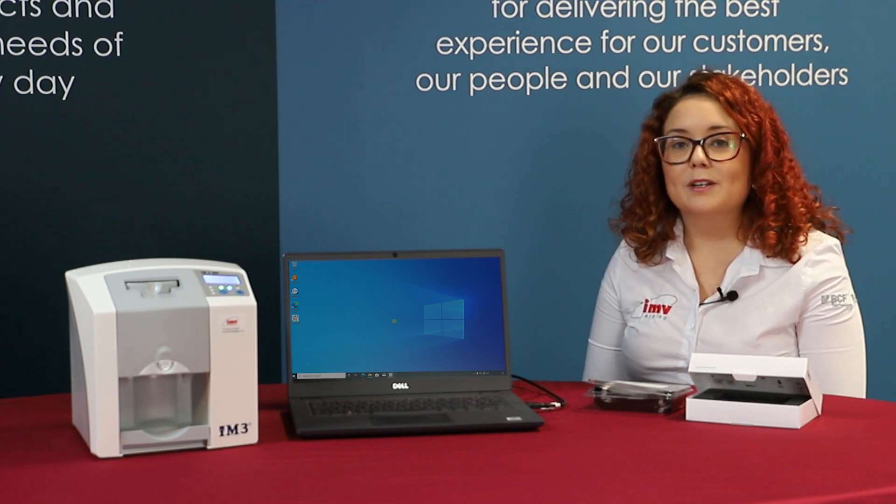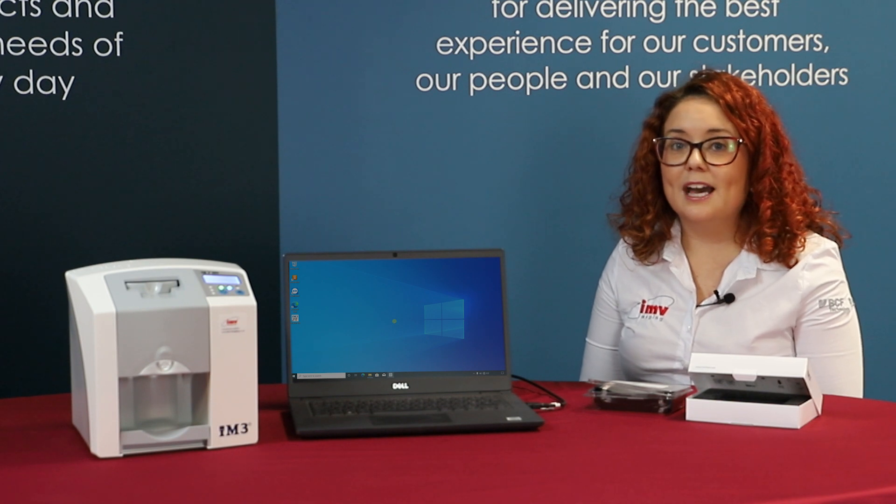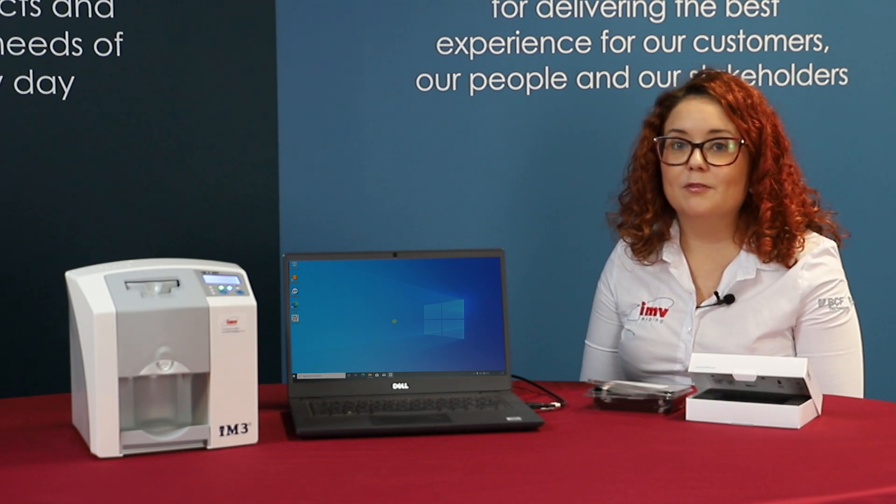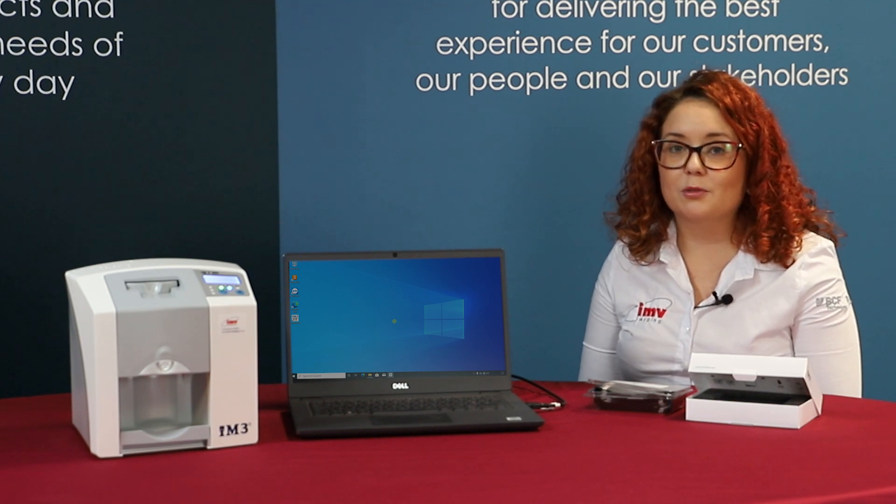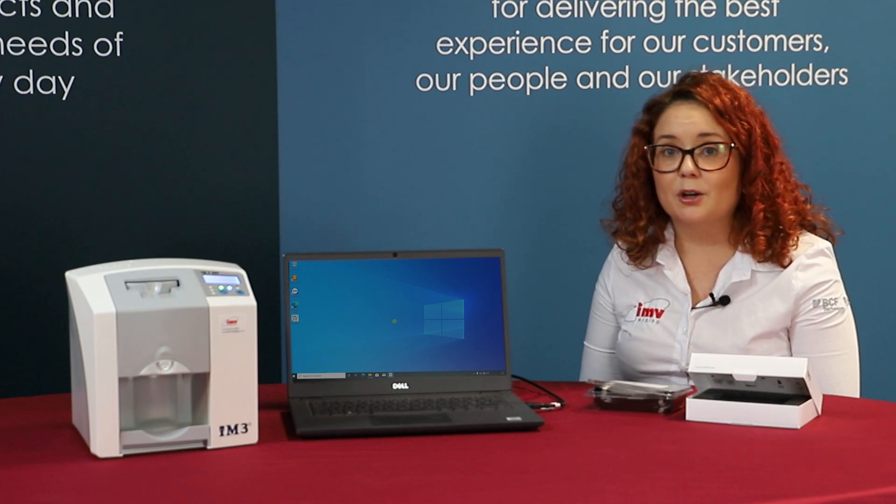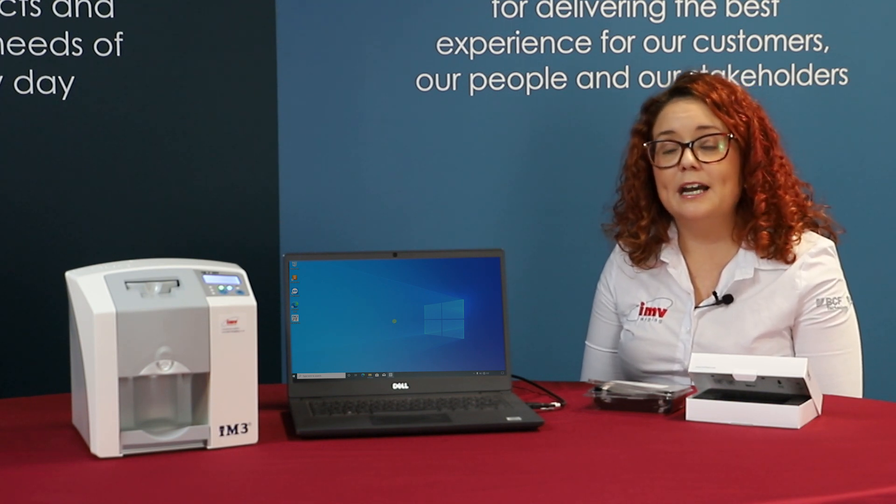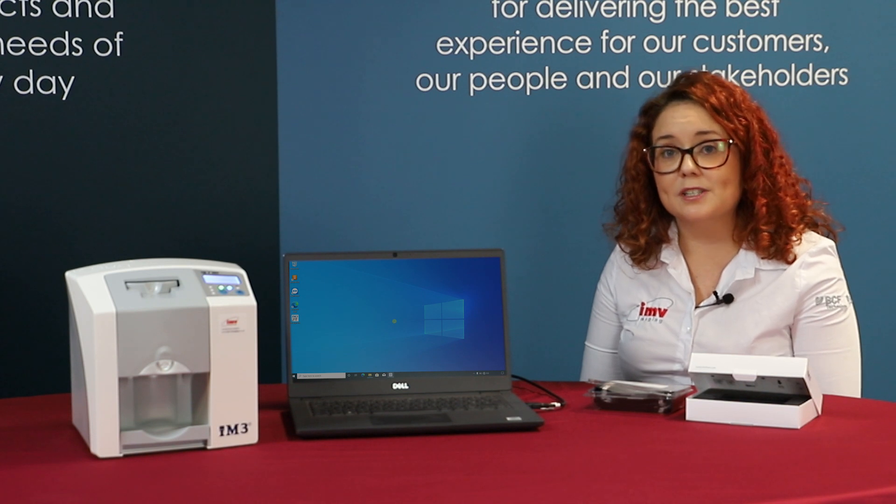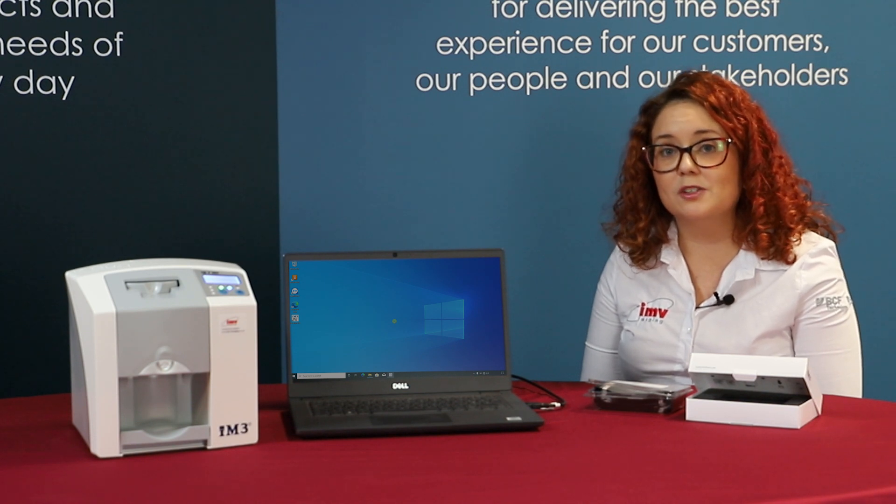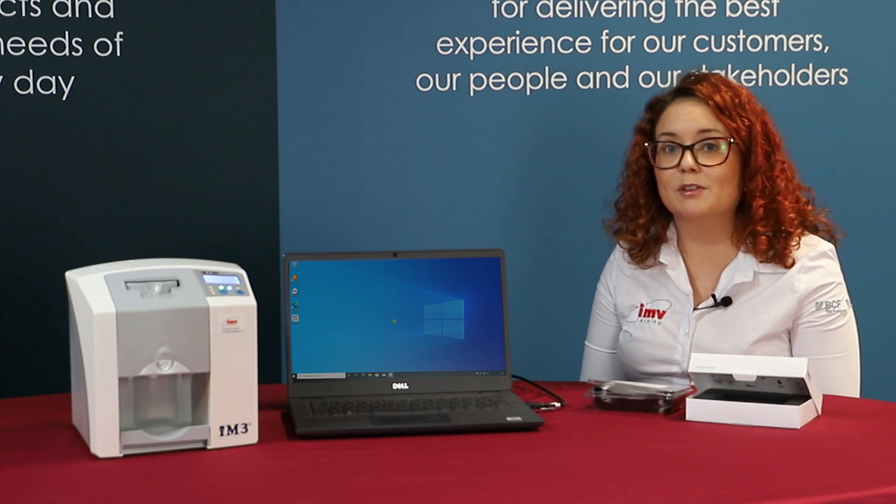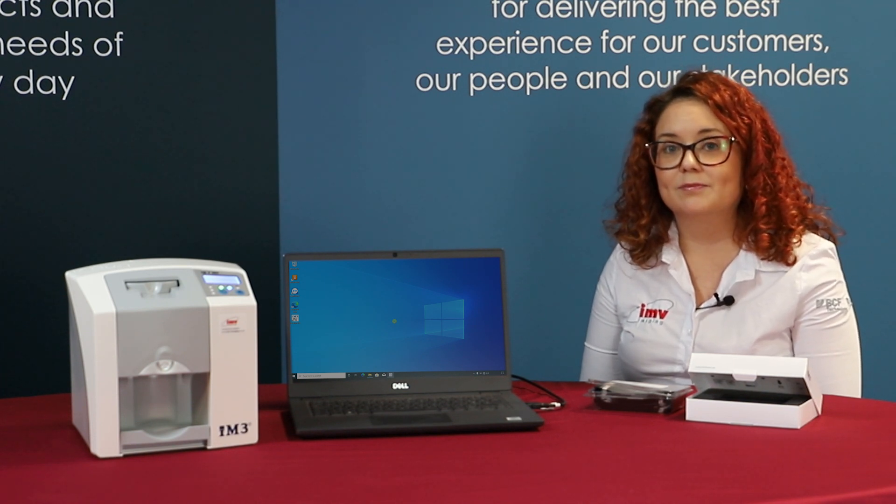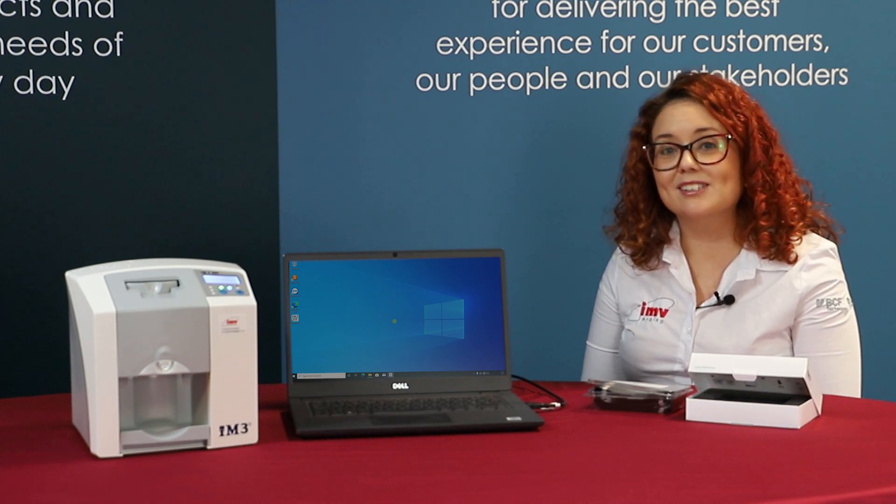Welcome to the IM3 dental how-to video series. First, we're going to start with how to set up your Vet Exam software on your laptop and then how to process your dental plates using the CR7 processor. Let's make a start.